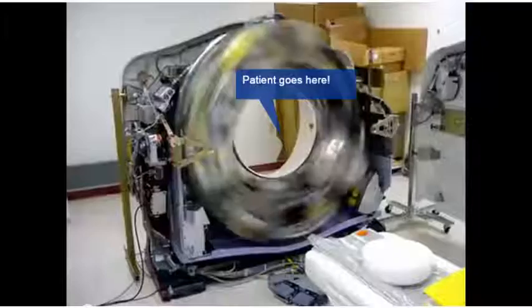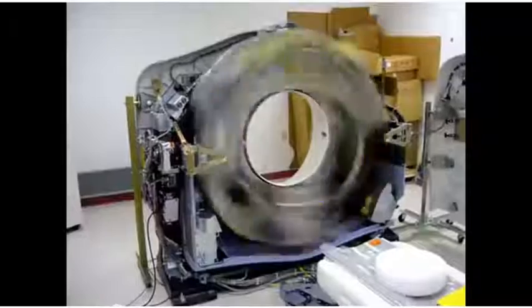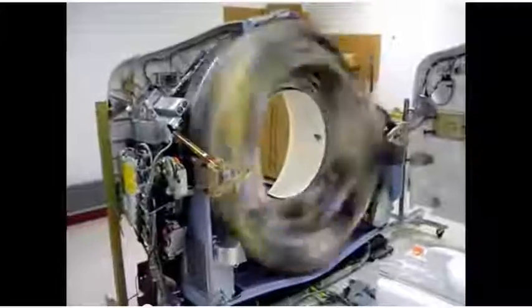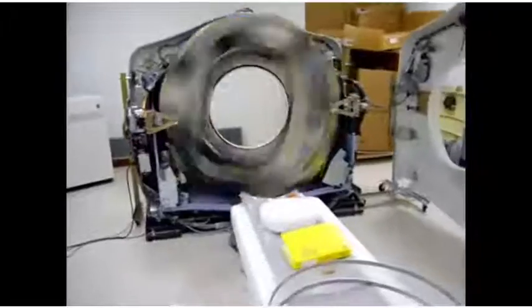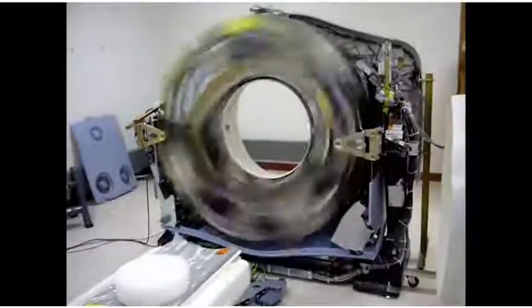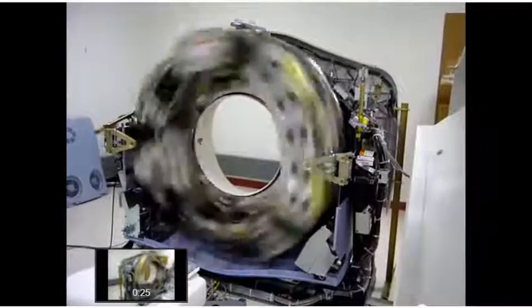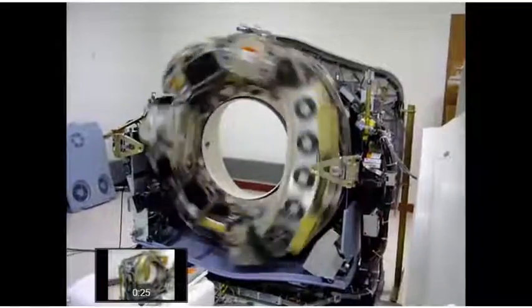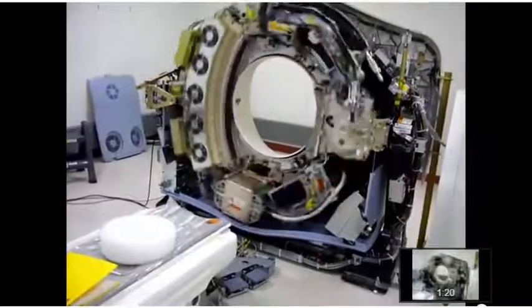These movements focus on spinning the X-ray a little like 180 degrees. This just spins like a semicircle, and then the detector moves into another position. This is more efficient, and it takes less time both to process and to take the analysis of the person, and this proves that a helicoidal movement is much more efficient than the old way.